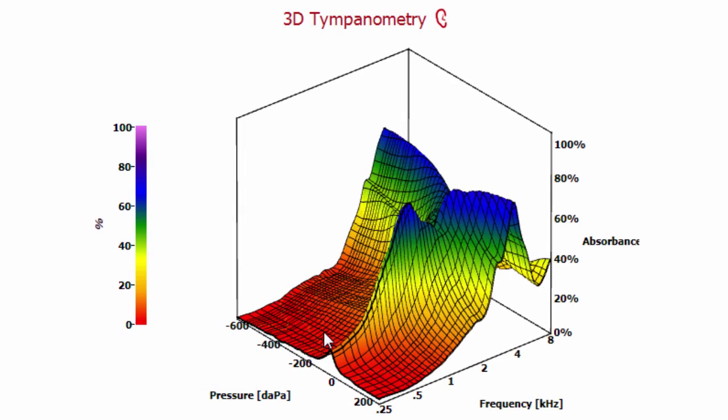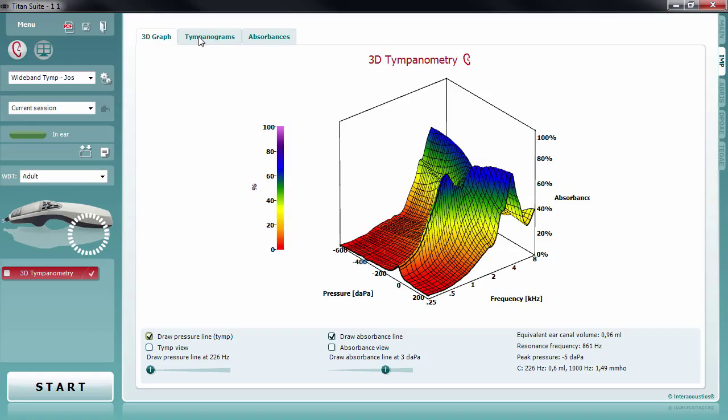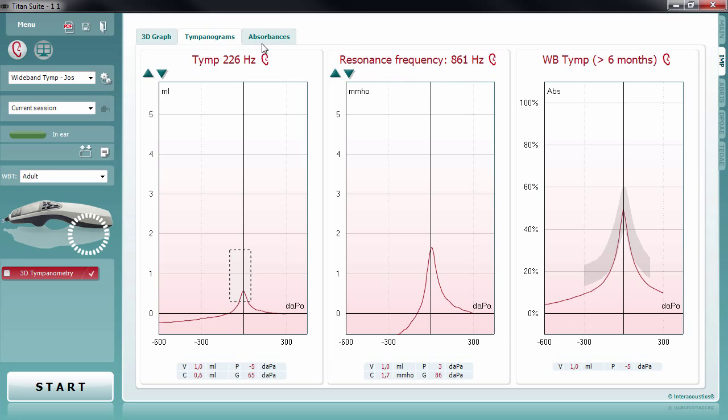Although you will learn over time to recognize if this graph represents normal or abnormal middle ear function, you do not need to make interpretations from the 3D graph itself. The data most commonly used for interpretation is displayed in the tympanograms tab and the absorbances tab.